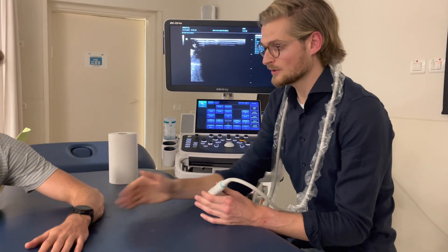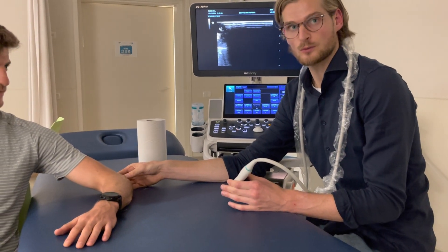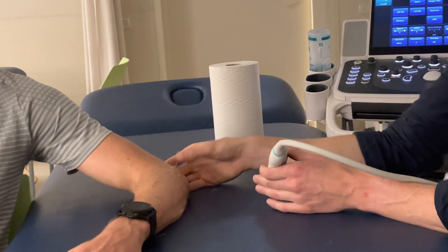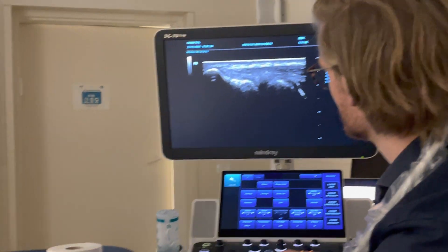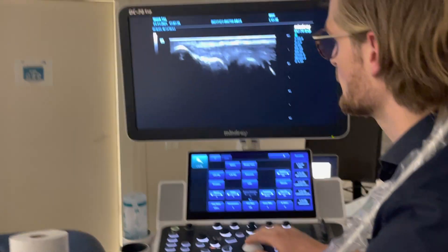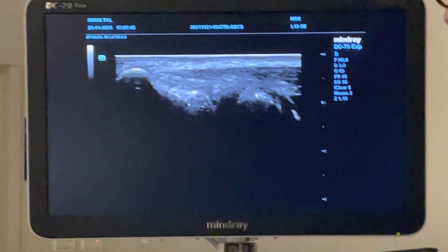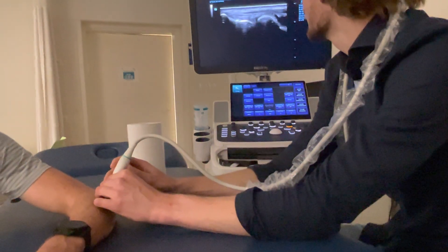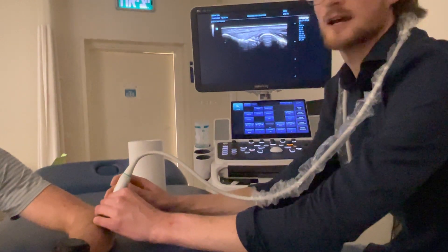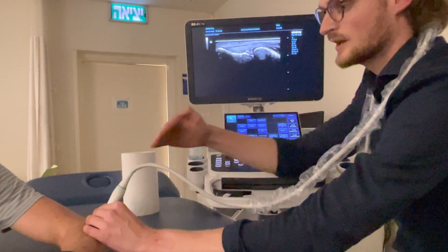We will start in a 90 degrees elbow flexion position. We can palpate the lateral epicondyle with our thumb and just remind to put it off because we have to put the probe on it. The probe is on the lateral epicondyle, but I don't see the radial head really clearly, so I have to rotate the distal part of the probe a little bit to scan the radial head really clearly. I want to see really clear bony lines, and we can go in this direction.